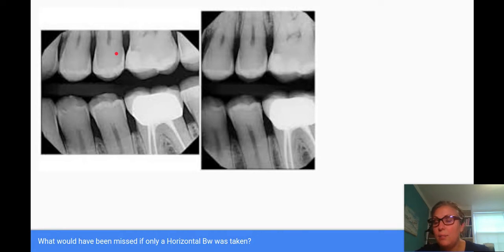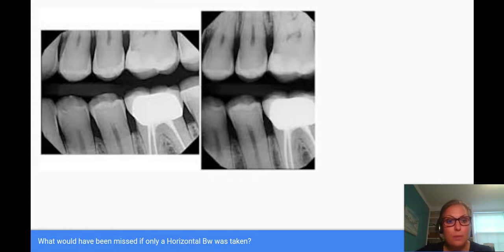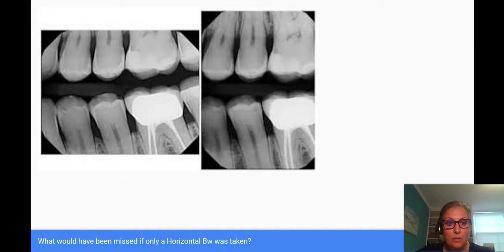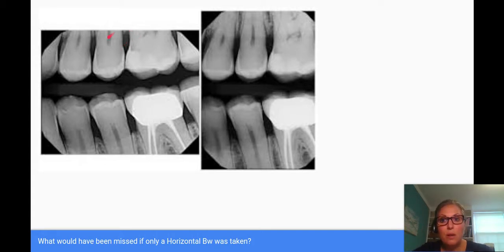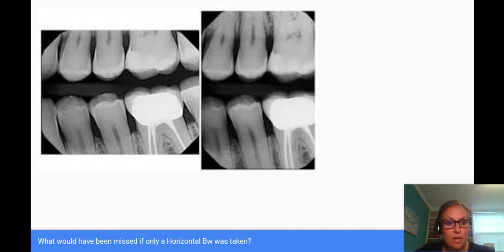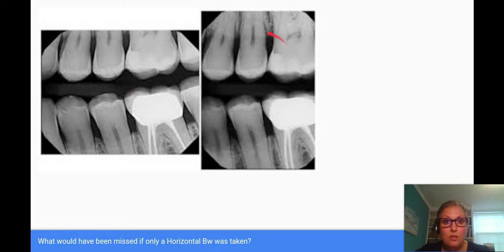This is not a big deal if we had taken a full mouth series, because we would have seen the bone on a periapical x-ray. However, there are some practices where only panoramic x-rays and bitewings are taken. While panoramic x-rays are fantastic and getting better with technology, some detail can be missed in a pan. So if a patient comes in with only a pan and four bitewings taken horizontally, this could have been missed.